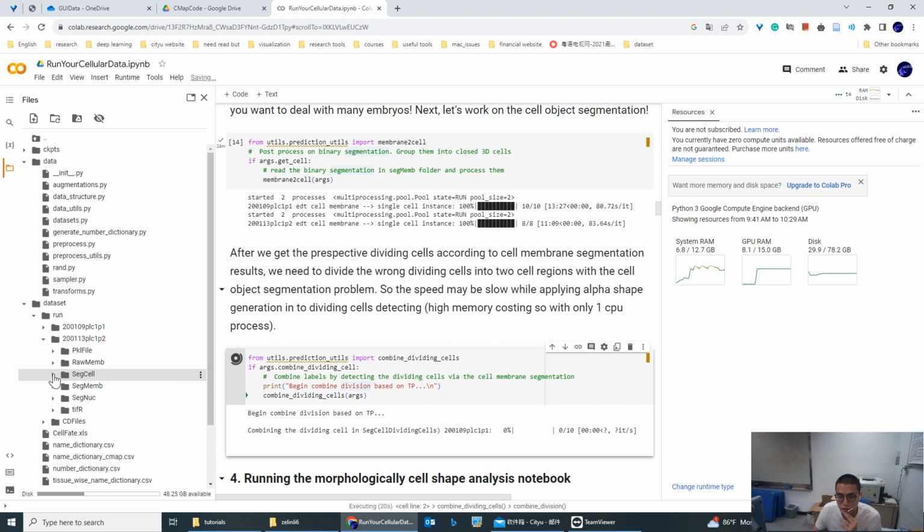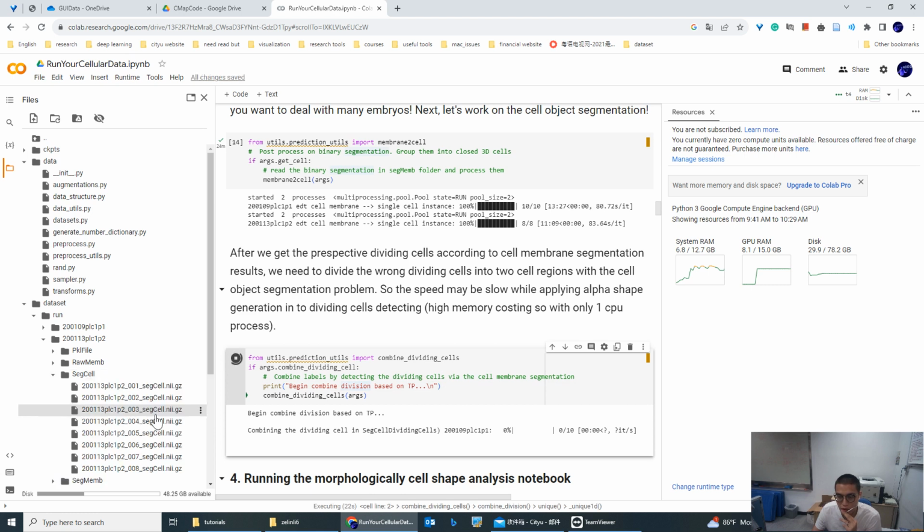If you want to open this nii.gz file with ITK, you should move it.